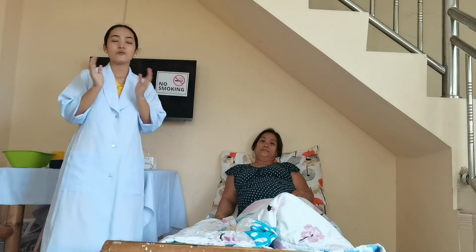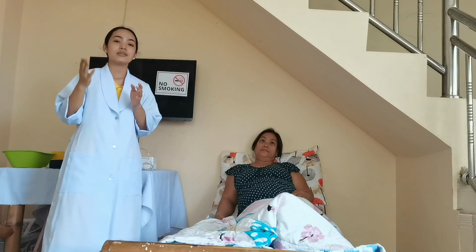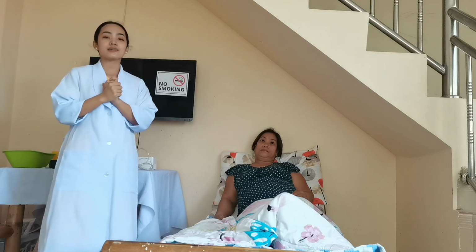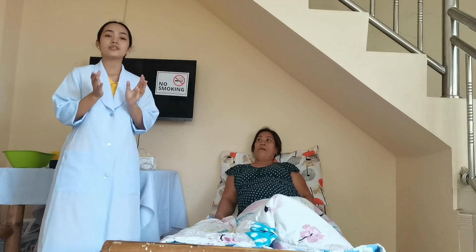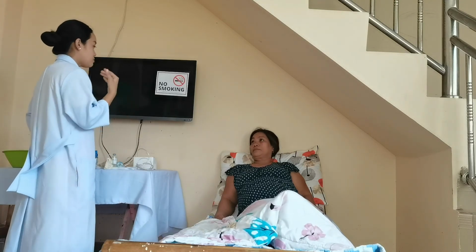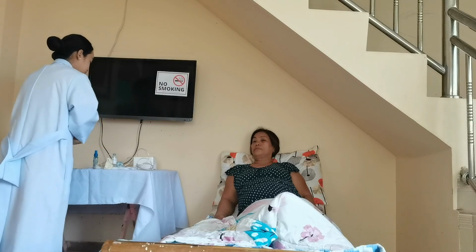And then lastly, we will have to reevaluate the client's response to treatment within the appropriate time frame, and we also have to reassess the client's lung sound, oxygen saturation, and respiration rate to see if the medication has been effective. So ma'am, i-assess ko lang po ulit yung lung sound po ninyo or pakikinggan ko po yung baga po ninyo. Okay po?